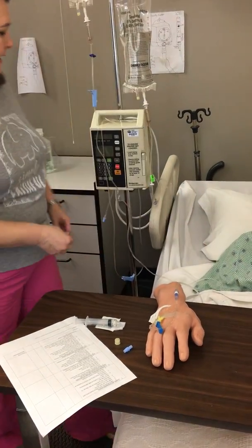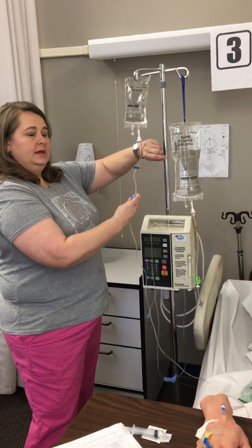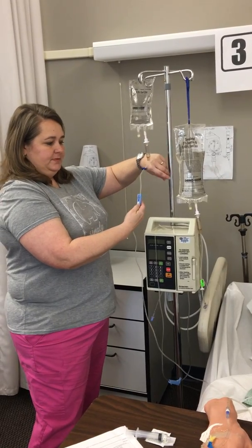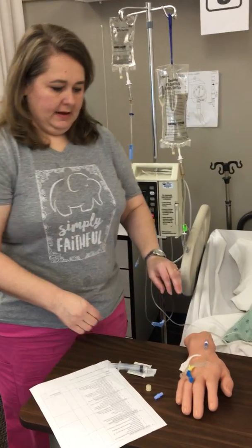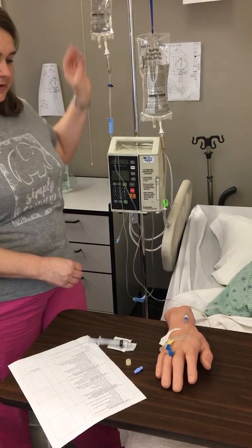At this point, this is where I need to use my roller clamp, and I'm going to calculate my drops per minute. I'm going to watch drops fall for 15 seconds and adjust my rate using this roller clamp. Once that infusion has completed, I will need to stop my infusion. This bag should be empty.